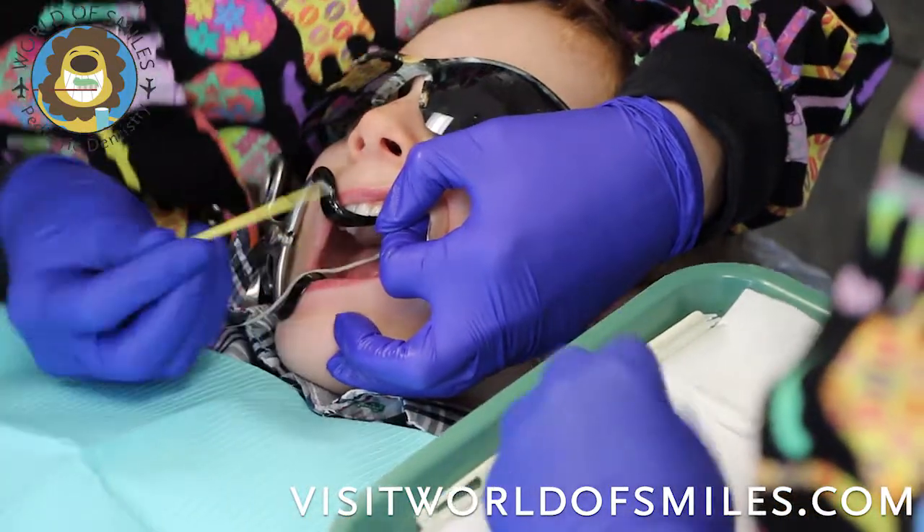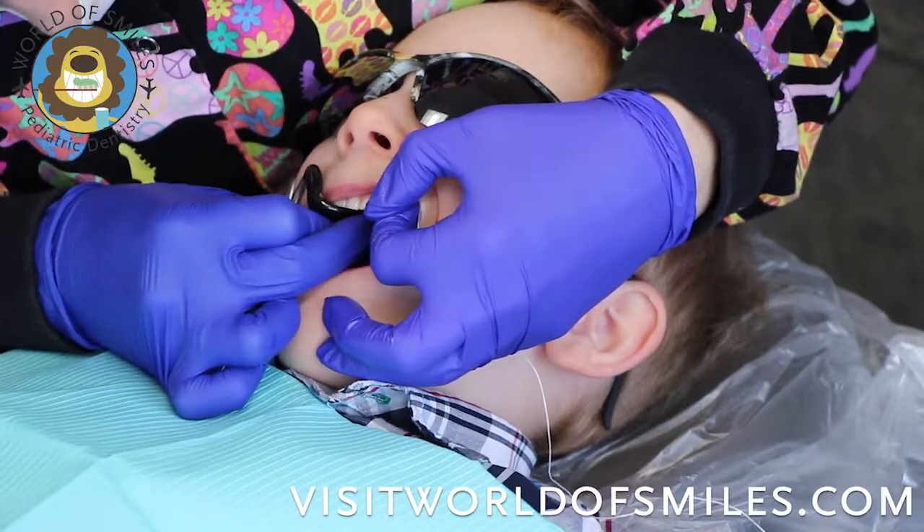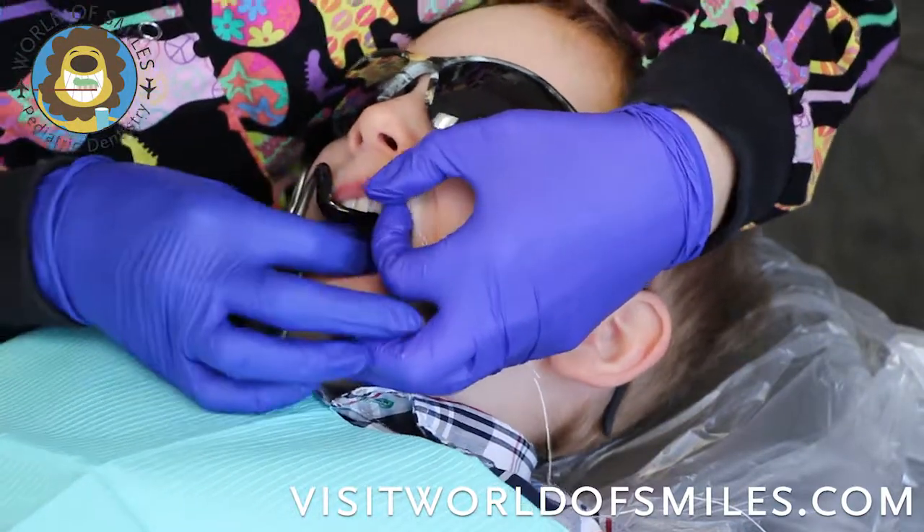Perfect, good job. And then we'll go back and forth a little bit with the super floss in order to get the cavity area in there and get that bacteria.